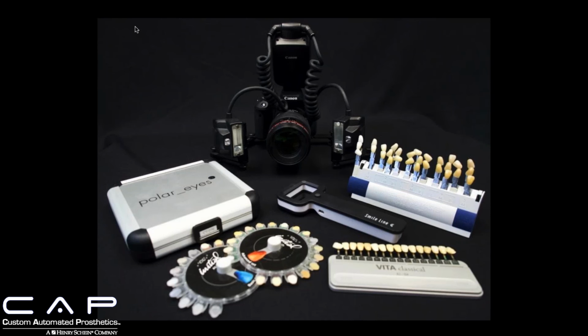In the middle there is the Smile Line Smile Light, which has become essential in my shade taking kit, and that's a color corrected light that you can use to pick your shade tabs, whichever ones you're going to be using. Sometimes your lighting, whether in the operatory or in the lab, isn't always perfect, so this really helps with that.